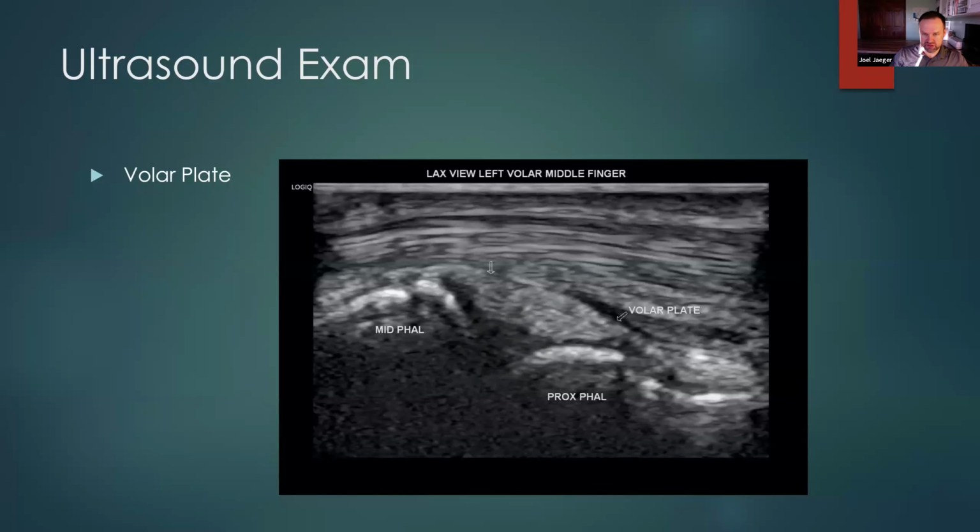From the videos I've seen of this, I haven't actually done one of these in my clinic, because typically when I'm seeing the avulsion and treating that, I tend to just jump to treating the patient. But when we're looking for those things, that little bit of movement can help your eye catch it and make it so much easier to visualize the pathology.